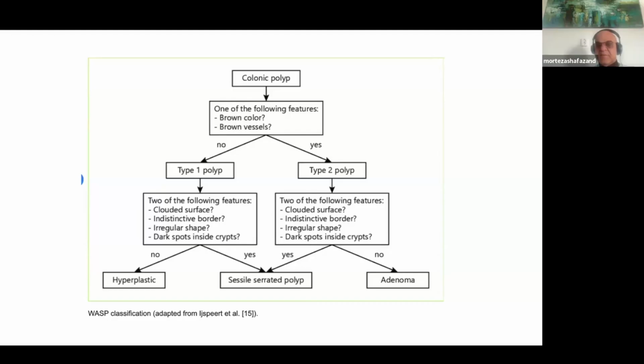And it's funny, because until recently this SSL detection rate was not really a thing. And even now, when it's being implemented, it's being implemented at quite a modest 6%. Six percent is too low. I think 15% is where we should be, but only the future will show. We just need more data, and there's a lot of work going on in that field.